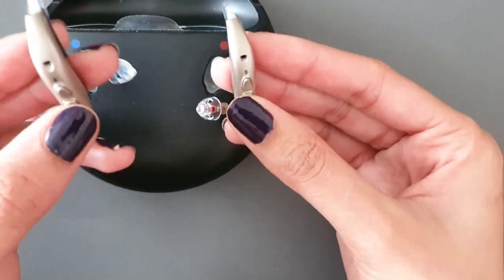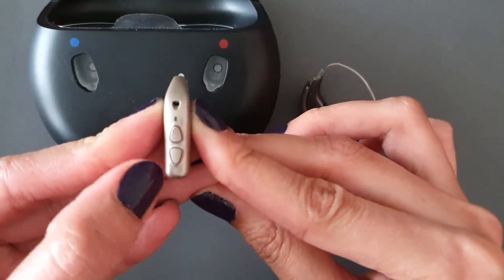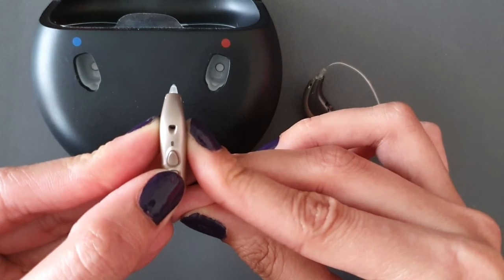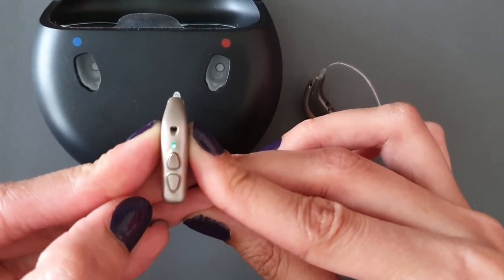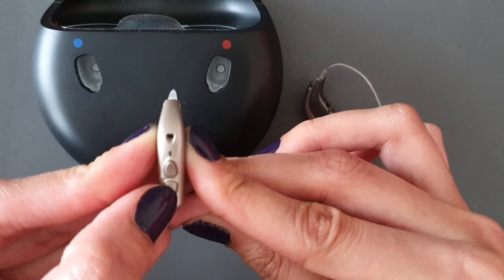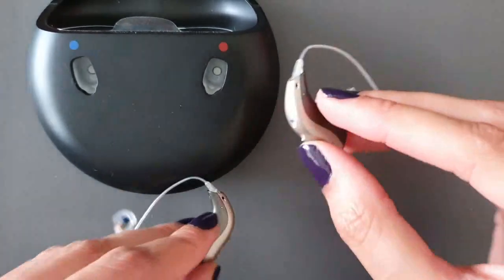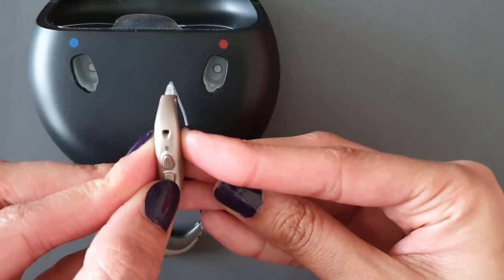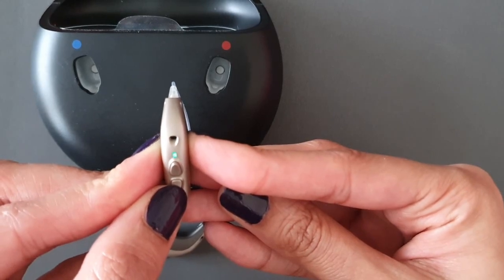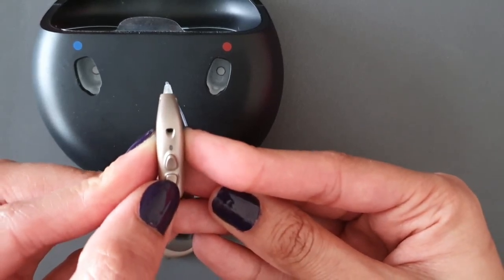There is also a manual way to turn your hearing aids on and off. On your hearing aid there are two buttons — top and bottom. Hold down the bottom button until you see a green LED light to switch the hearing aid on. To manually turn them off, hold the bottom button again until it flashes red, meaning the hearing aid is switched off. You will need to do this for each ear.